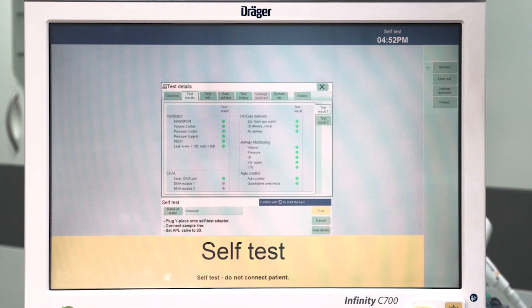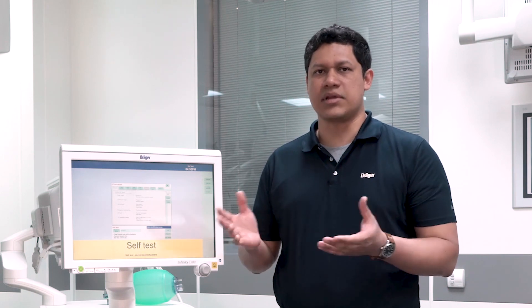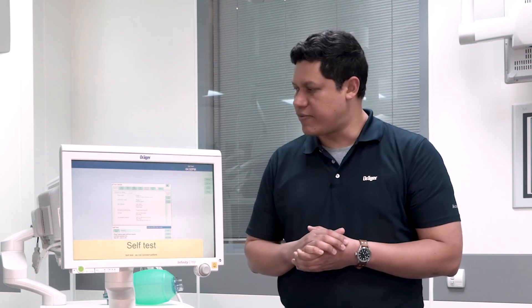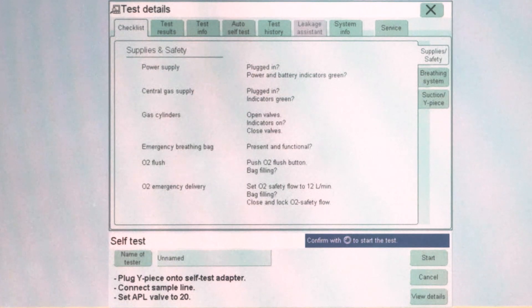In the display, you will see the test result, but first you will have to verify on the checklist. Here you will verify all the different components around the anesthesia device. The first group of components to verify are the ones related to the supplies and safety.